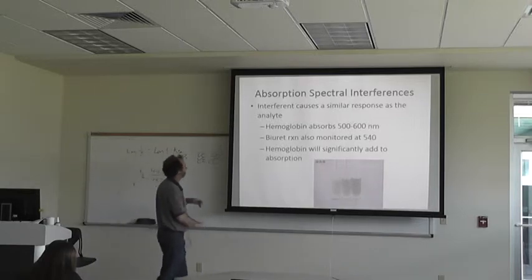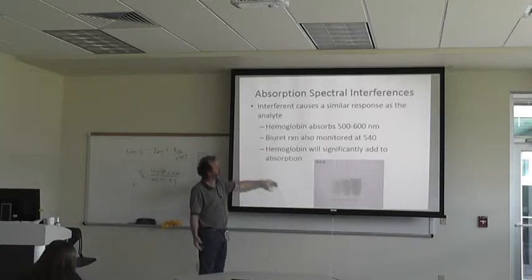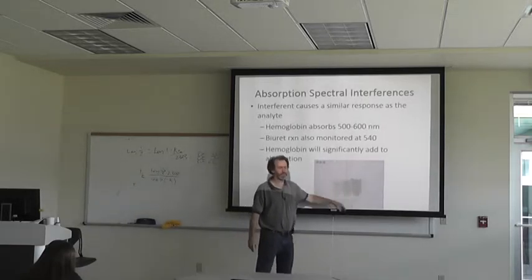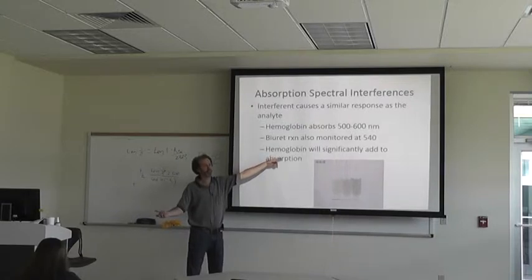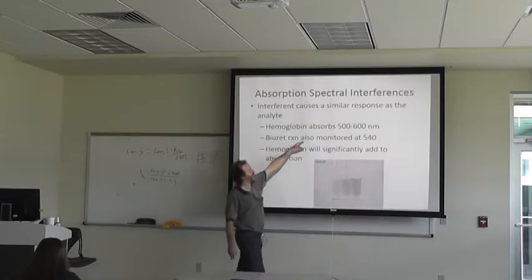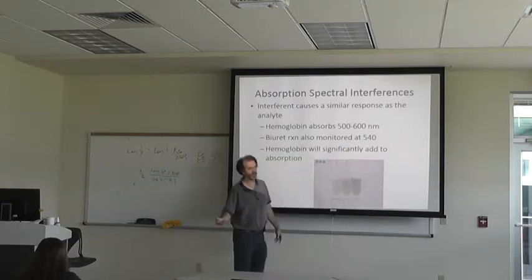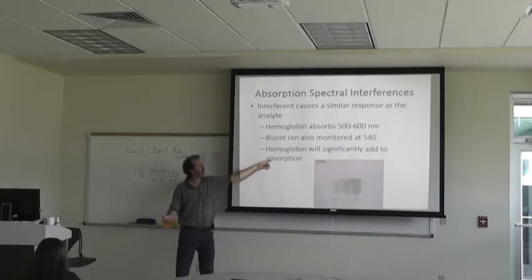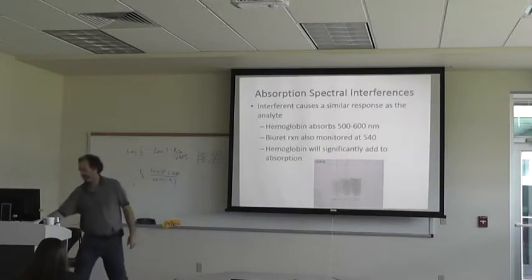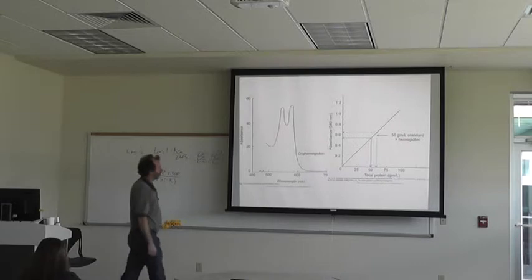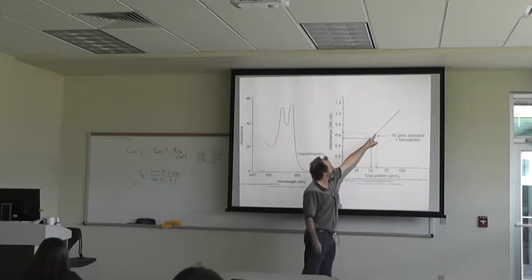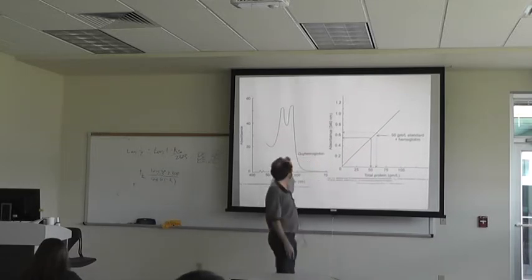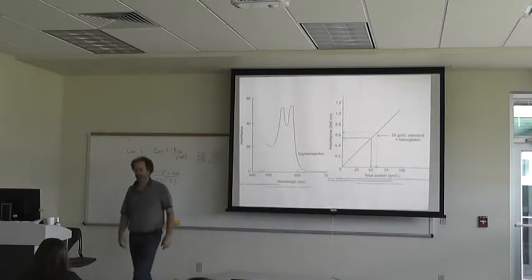Absorption spectral interferences: an interferent causes a similar response to the analyte. Here's an example of different amounts of heme in samples — you can see it gets redder and redder as concentration increases. Hemoglobin will interfere with the biuret reaction, which measures protein concentration. Hemoglobin absorbs at 500–600 nm and the biuret reaction absorbs at 540 nm, so it will add a significant amount of absorption and throw off your standard. Here's an example of a standard curve where hemoglobin was added — it appears like there's more than there should be.